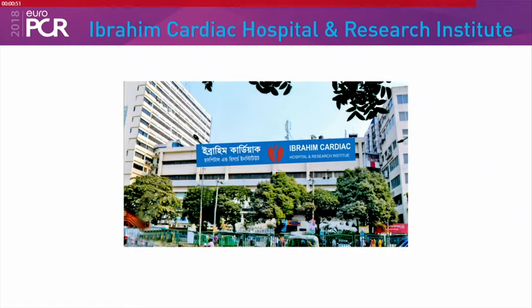Actually, he's one of the best fellows of my hospital, and I was one of the operators who has done all these jobs here. But in the previous cases, in my hospital actually 99.9% of cases are transradial, and I use a 5 French guide catheter in about 90% of cases. So I always try to keep 2 or 3 points which I can share with you.